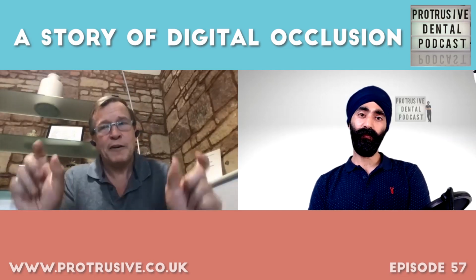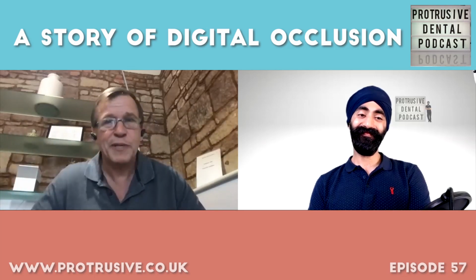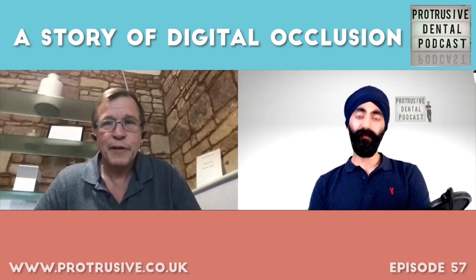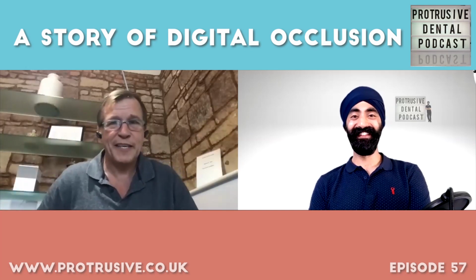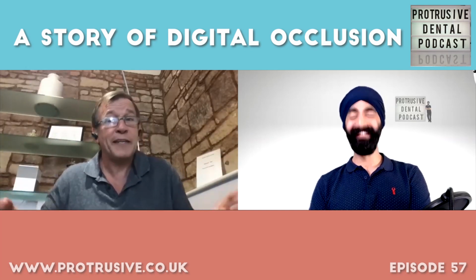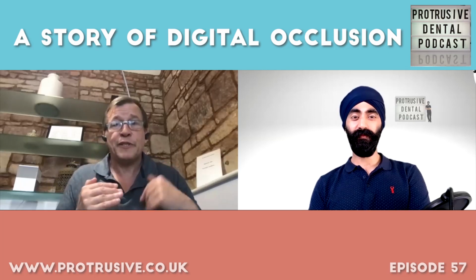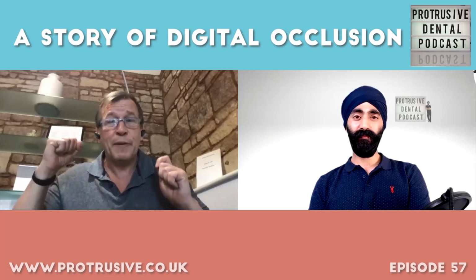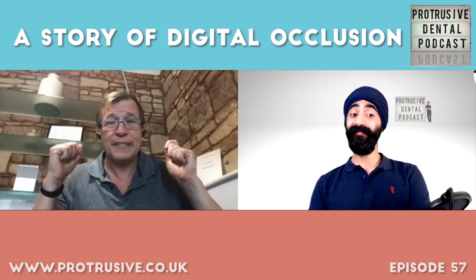I think they allow, excuse my lack of knowledge, something like 9 millimeters, because that's where we think that is. Well, look at my fat head and then look at lovely slim Jazz. I think we're probably a little different. So we're making an assumption straight away. And then if we're going to use it to get the incisal plane, what are we going to do? I'm actually going to fudge it round in the ears a little bit. Oh, that's super accurate.